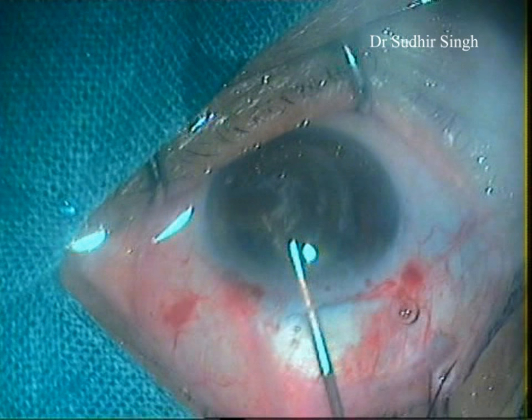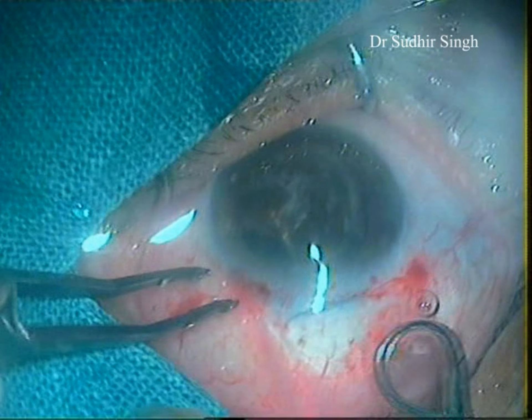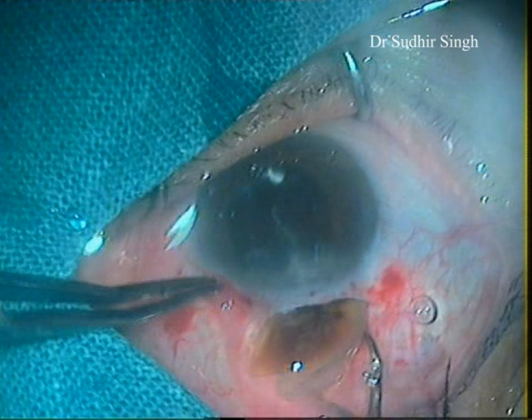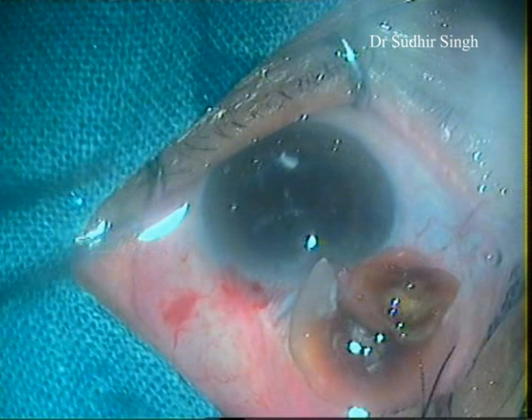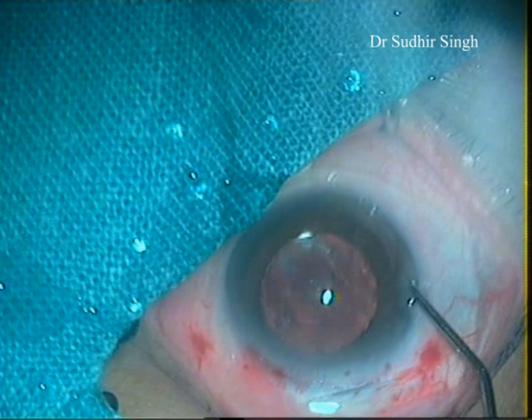Again, viscoelastics is placed between the cornea and the superior surface of the nucleus, and between the nucleus and iris. The vectus is introduced through the tunnel and positioned between the iris and the remaining part of the nucleus, which is then taken out. Cortical matter is cleaned up. A single-piece 6 mm PMMA intraocular lens is implanted into the capsular bag.